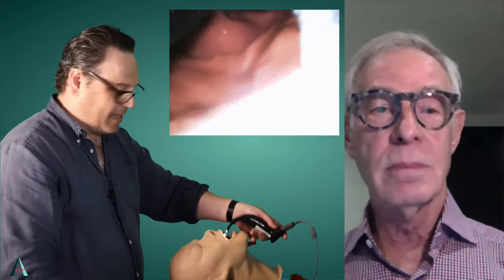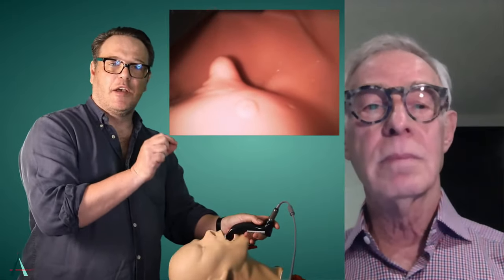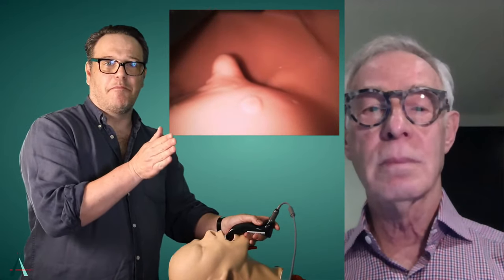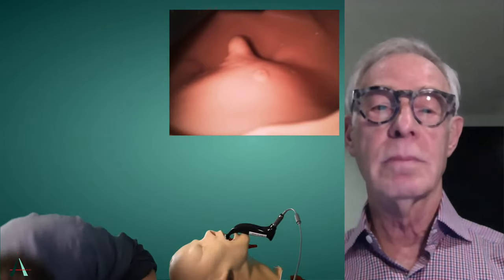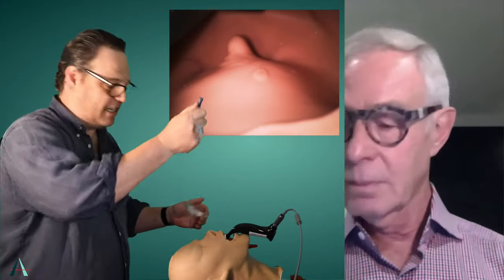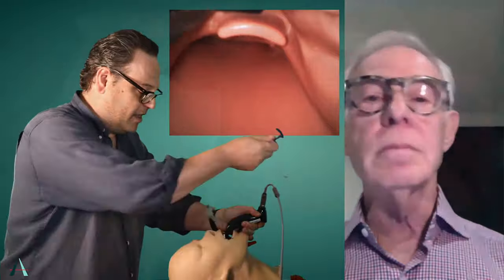So midline insertion, positioning the stiletted tube in the midline, below the arytenoids, between the arytenoids and proximal or before the arytenoids, and then doing the Cooper maneuver, which I'll just demonstrate here on screen for everyone, because this is really the critical part of it, and it's not an intuitive maneuver because we don't usually ever lift a tube like that. We usually do this, and that's the thing. And you can see there, maybe go to the close-up if we can on the other shot.